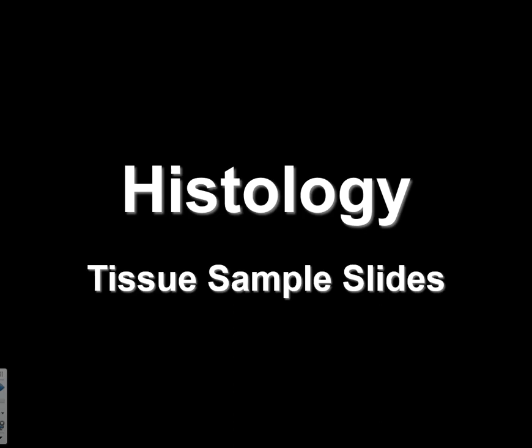Hello. So here's just a little walkthrough on some of the things I see when I'm looking at these slides to help me identify what they are. So let's take a look at epithelial tissue first.